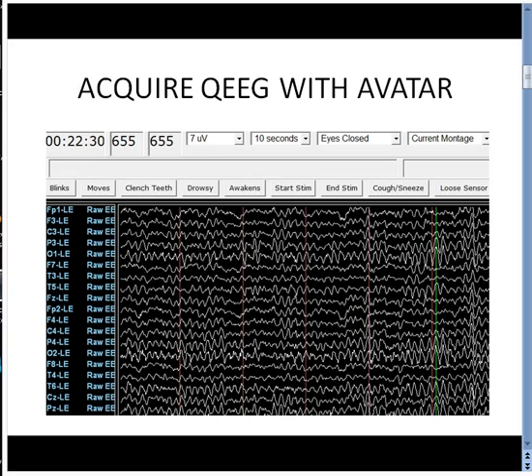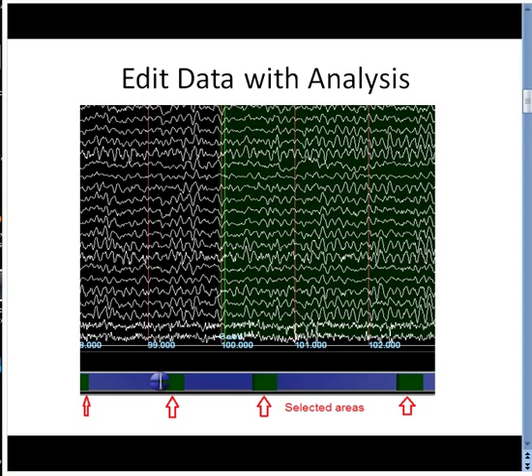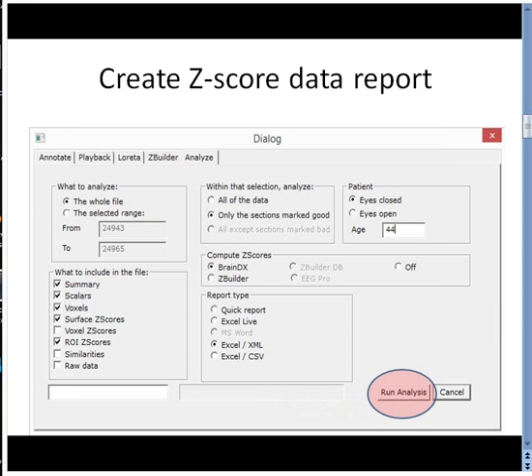To recap: first, we acquire QEEG data with Avatar. Second, we edit that data with Brain Master's software tool analysis. Third, we generate an XML report with Brain Analysis. The report will automatically be sent to the client folder.